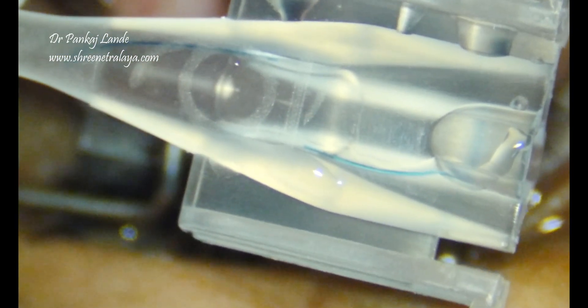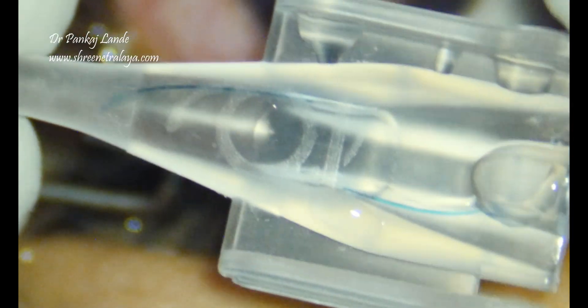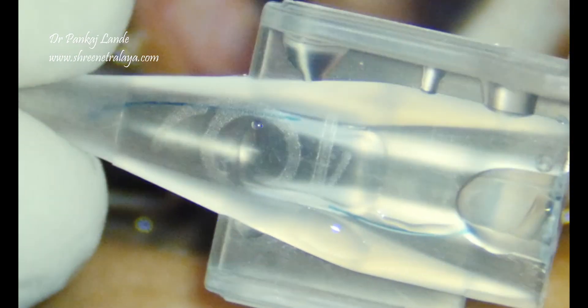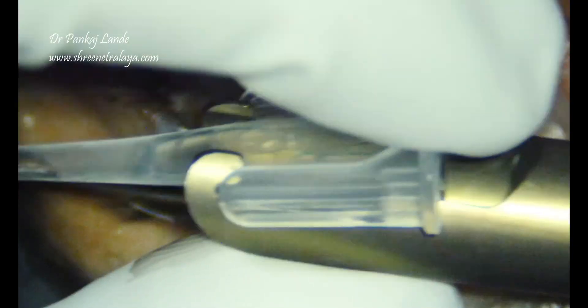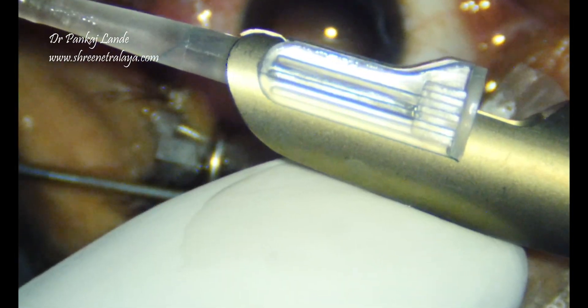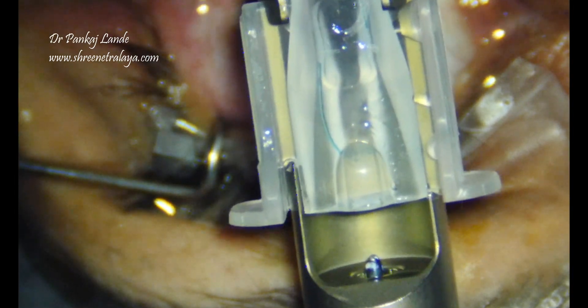You can see the front side of the haptic is very well spread and the optic is sitting nicely in a groove without any movement. This cartridge is now fixed into the injector of the J&J single-piece IOL injector.